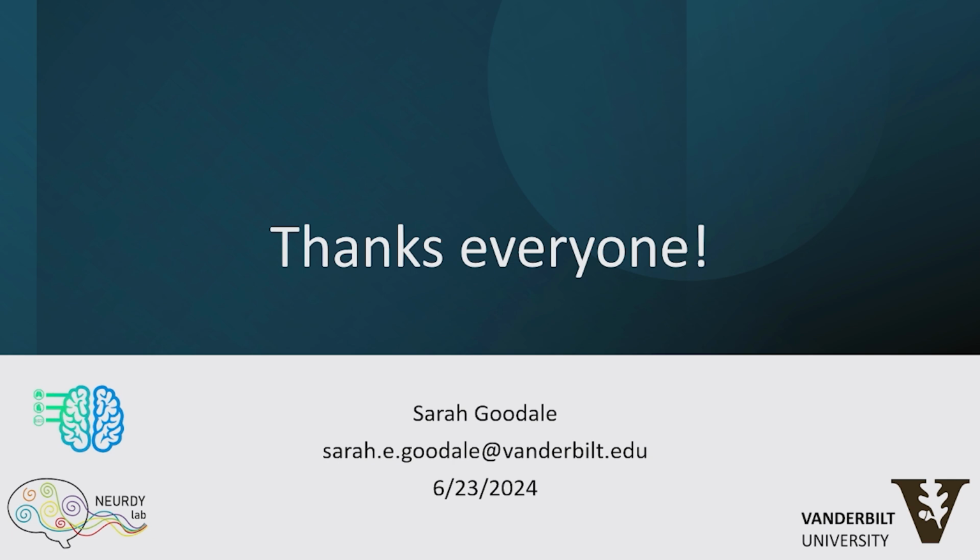To my knowledge, no. Typically in that situation, if we have an acquisition, we really do value the physiological data that we collect. If we're only about 5 to 10 minutes in and we collect about 20-minute scans, we actually will stop and start over. It's really difficult to retrospectively fix big chunks of missing physio data or any issues with that.